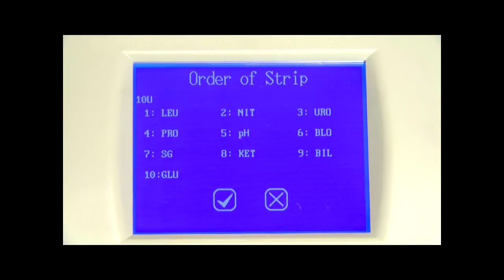Next to each number, select the parameter desired. Blank means that no parameter will be displayed for that position. For example, if LEU is selected for position 1, then LEU is the first parameter to appear on the results screen and on the printout. Once the proper order is selected, press check mark to accept the change and return to the main menu, or press cross mark to return without changing the order of parameters.